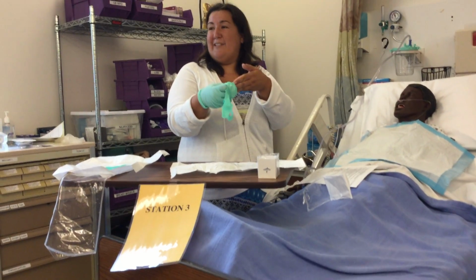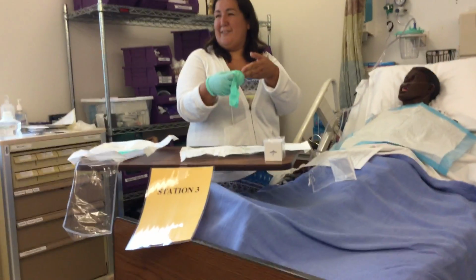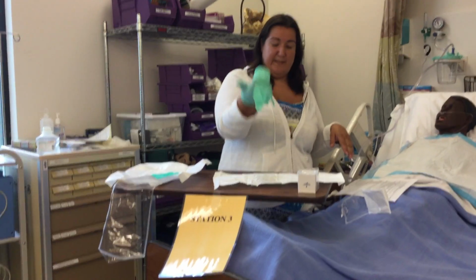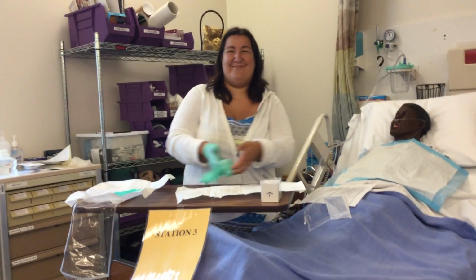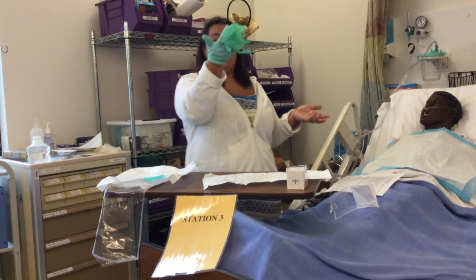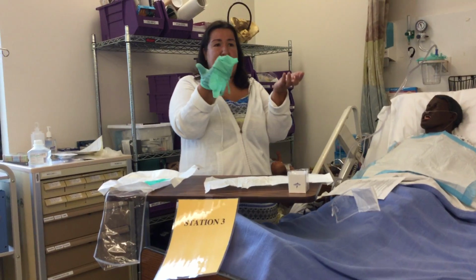Now I'm putting my hand in, what am I doing? You're contaminating your thumb. So that's probably the most common thing I see people do. And watch where you put this. If you're doing this, what am I doing? Contaminating. And you get nervous and you don't realize it. So kind of bring it up. Bring it up. You want to have things above the waist.